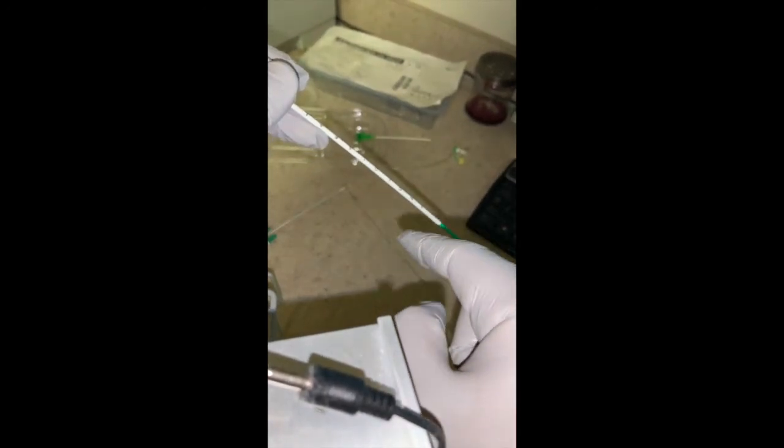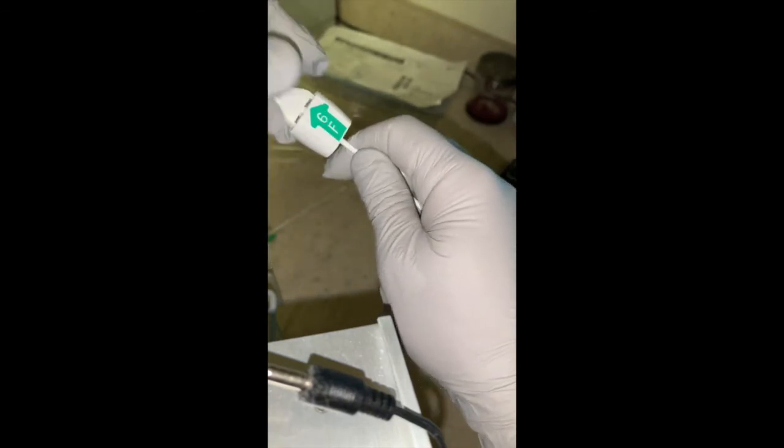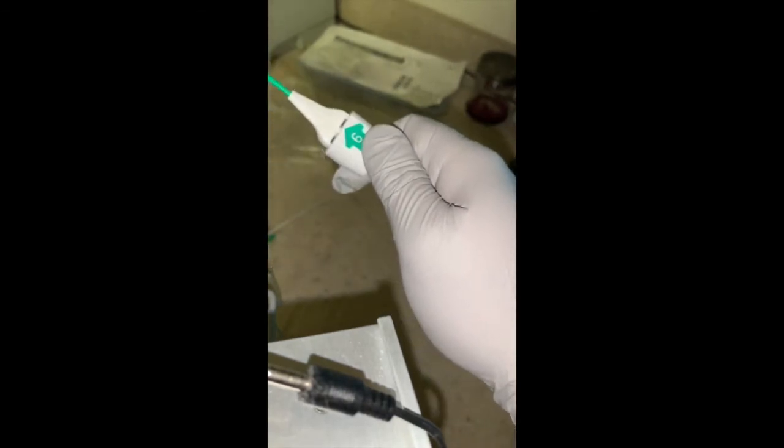Once your device has appropriately reached inside, there will be a little side hole which will start to squirt blood out. Some people recommend pulling back until that bleeding stops and then pushing back down again until you see the bleeding again. Once you've done that, you secure the Angiaseal so that it does not budge at all.